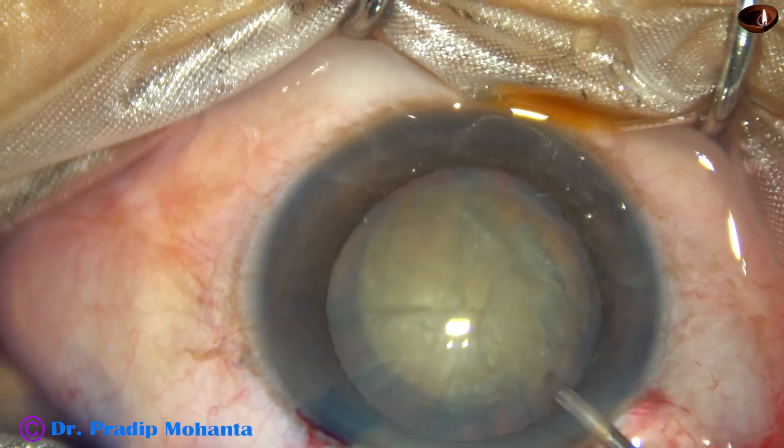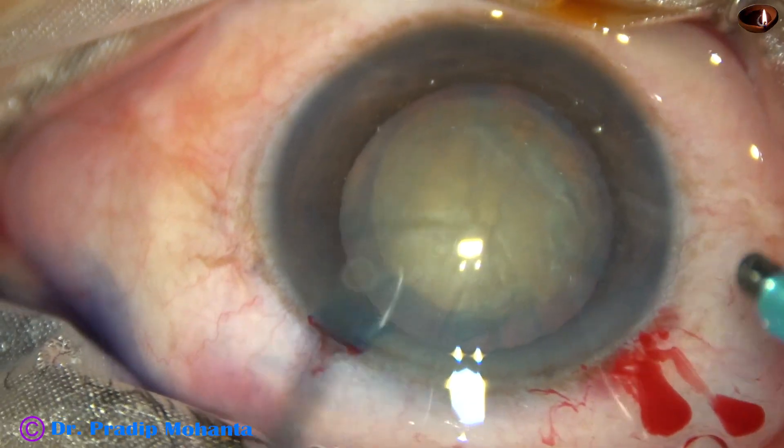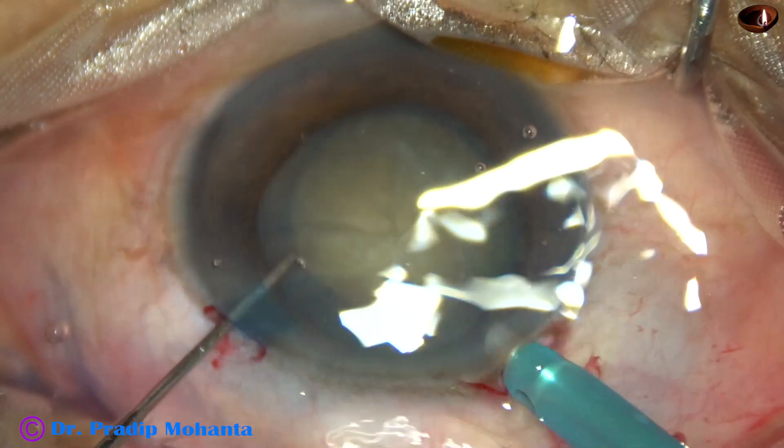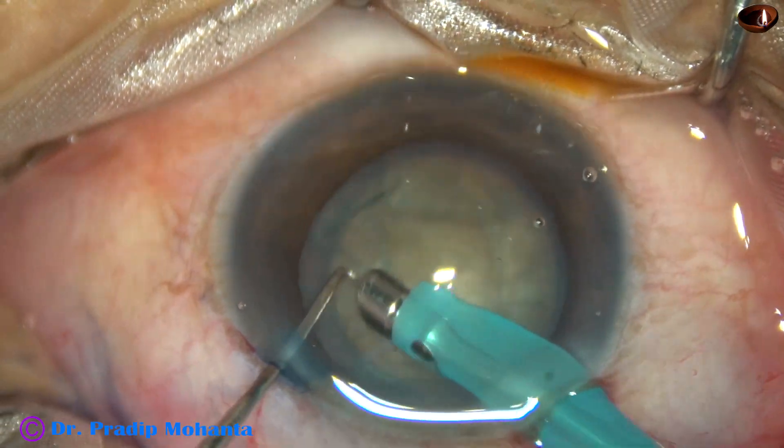Some more visco is applied. Now the phaco needle is introduced into the anterior chamber. Let us observe the submarine chop technique.